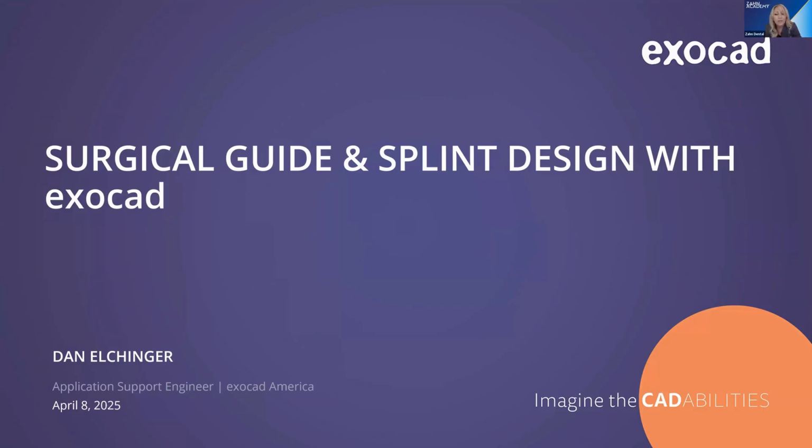I can't even tell you how many great calls I've been getting just thanking us for this time that you're spending with them. Today's version is surgical guide and splint design with exocad.